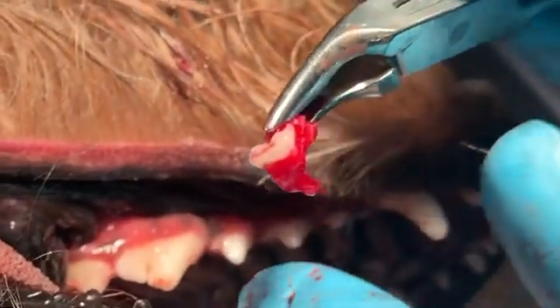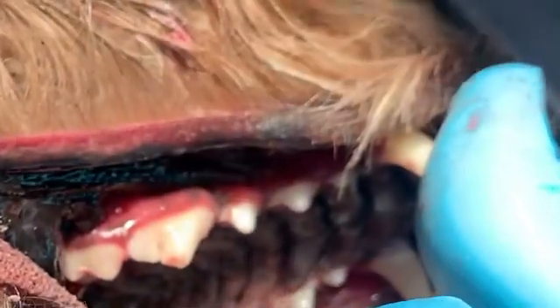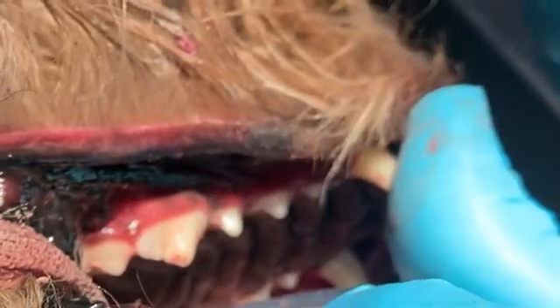You can see it has very short roots on it, so they're really not likely to break off. Don't try that on any other tooth — I tried it earlier in my career on the next one here, and you almost always break the palatal roots. So it's the only tooth you can do it to, but it's a pretty cool trick.